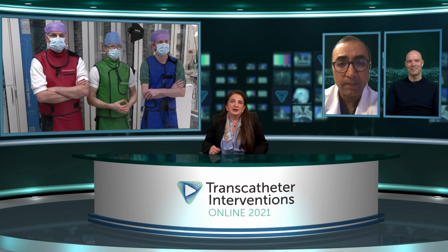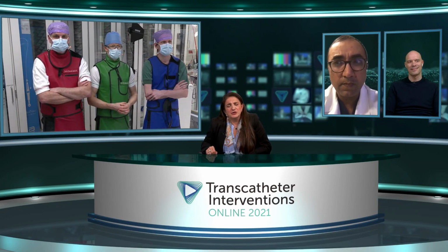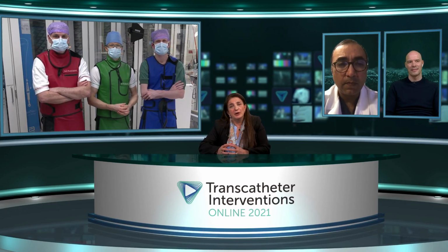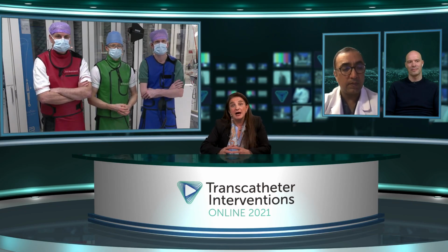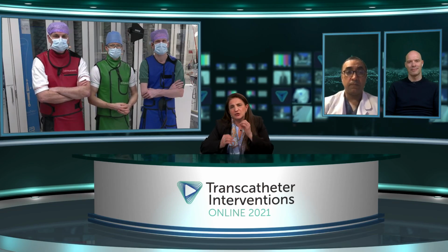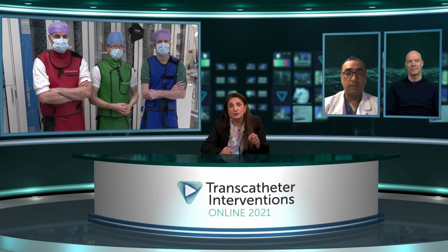No, there's no question about it. And Niels and Ole, what a beautiful demonstration. What I loved about your team is this cohesive way of approaching this patient, planning it with CT, the 3D imaging, and then the use of ICE in a totally awake patient, with the delivery of the device so precise into the left atrial appendage, so well planned. Tell us how you got there, and why did you choose this over the Watchman?